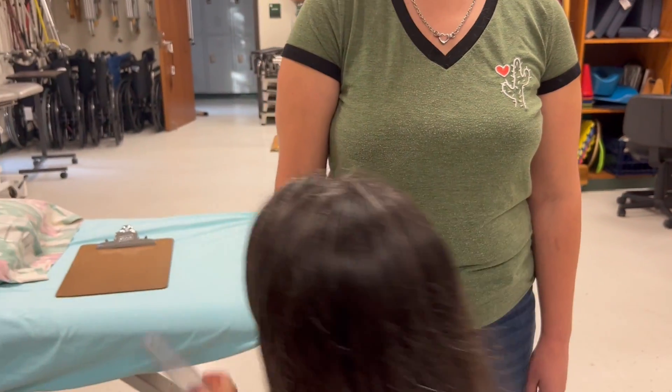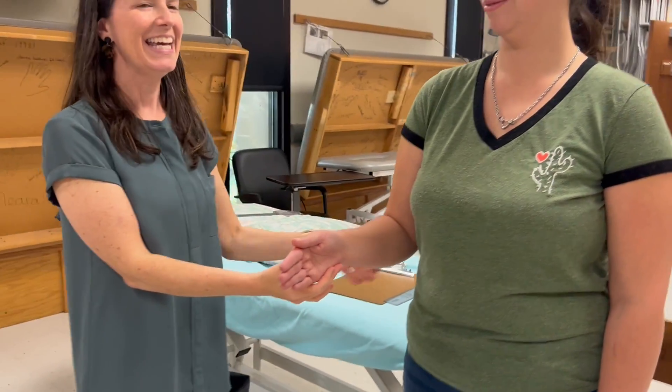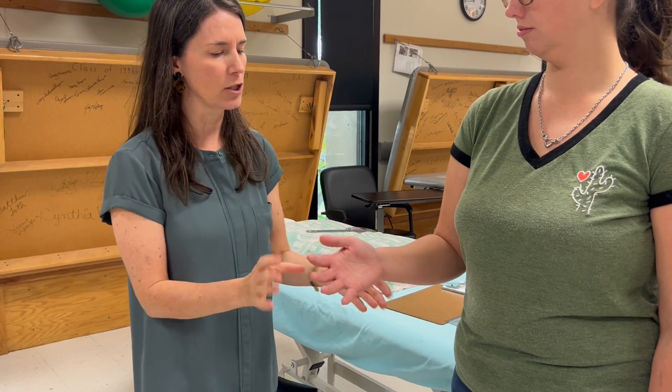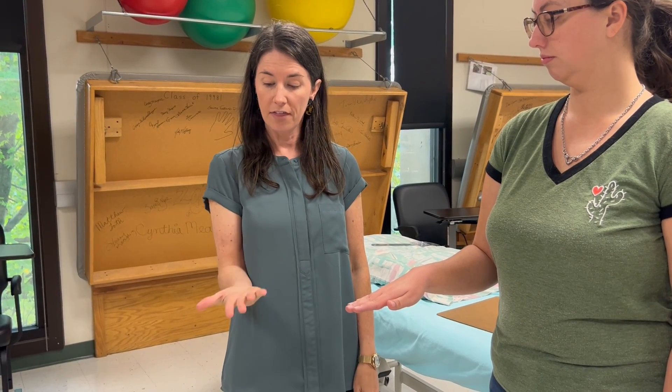Now we're going to do some MMT. We always start with grade three. We just did supination first with goniometry, so we'll measure MMT for supination. We're going to start fully pronated, because MMT is movement against gravity. The only portion of this motion that is supination against gravity is from full pronation to neutral — if you continue going past neutral, you're still supinating but now it's gravity-assisted. So we only really care about the first half.